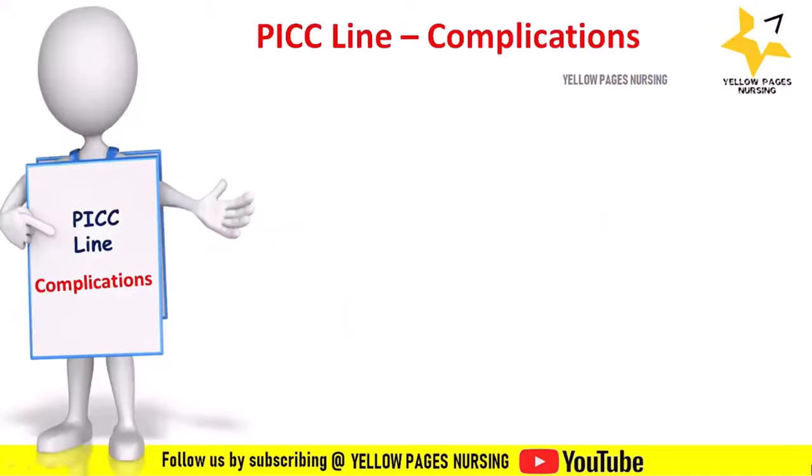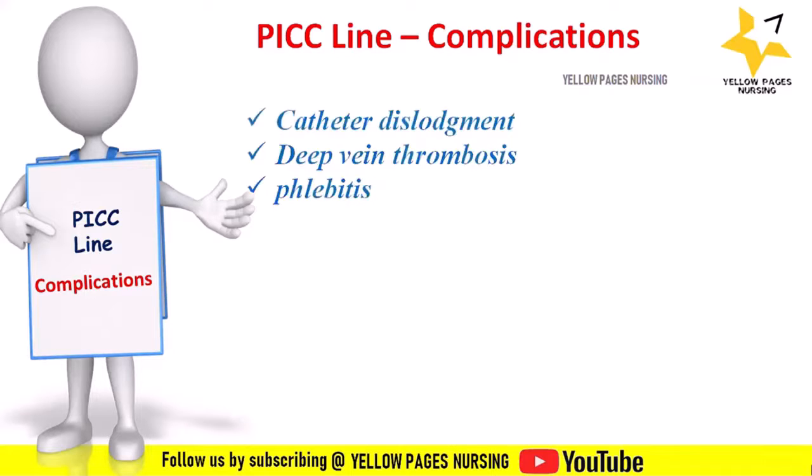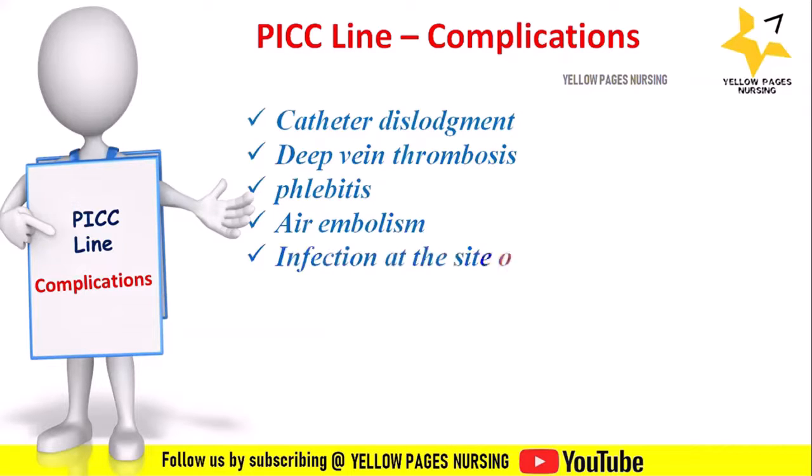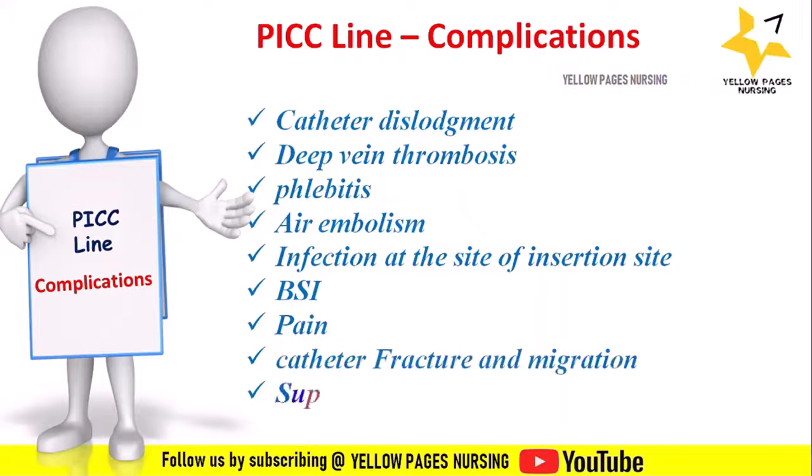The complications after placement of a PICC line include catheter dislodgement, deep vein thrombosis, phlebitis, air embolism, infection at the site of insertion, bloodstream infection, pain at the site, catheter fracture, catheter migration, and superior vena cava syndrome.